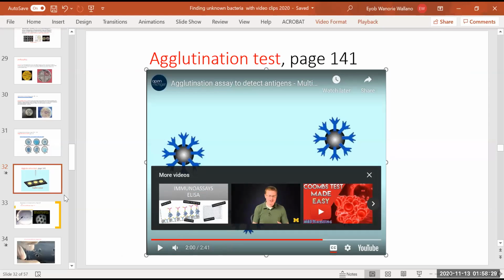Okay, in this one, you have seen how the reaction is going on. So this is a very delicate laboratory activity. If you don't have beads with a certain structure of adhesive character with antigen and then antibody, you can take blood itself.